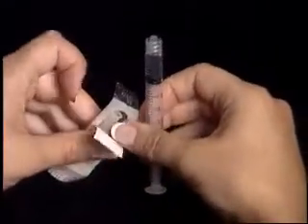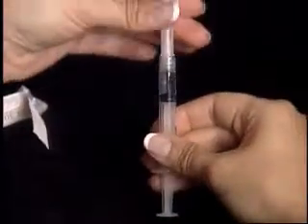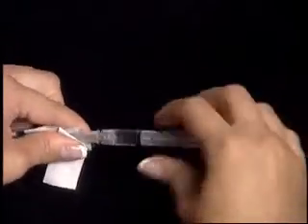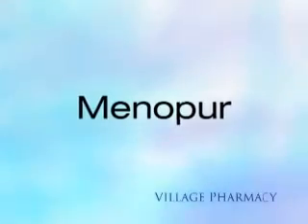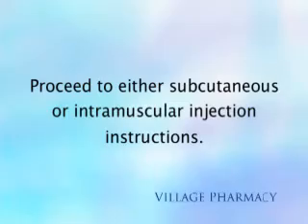Twist the syringe counterclockwise while holding the Q-cap steady to remove the syringe from the Q-cap. For subcutaneous injection, hold the syringe pointing upward and twist on the half-inch needle. Or, for intramuscular injection, twist on the one-and-a-half-inch needle. This concludes the mixing for Menopur. Now proceed to either the subcutaneous or intramuscular injection instructions.